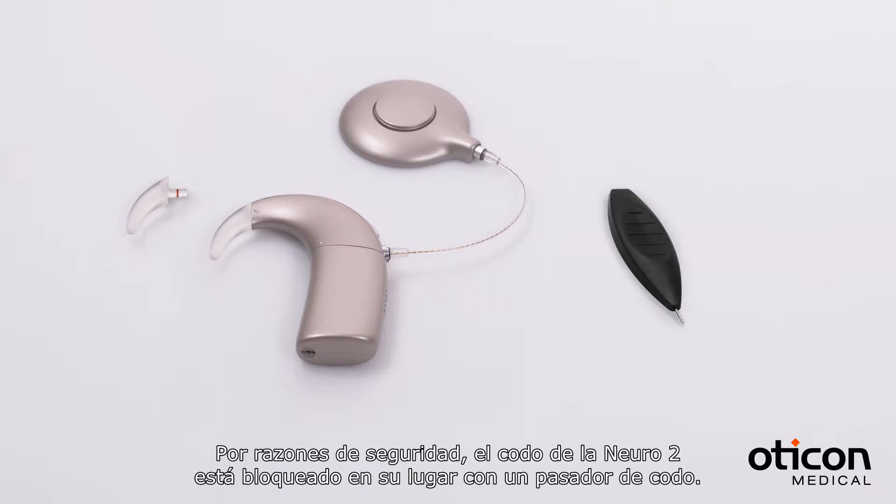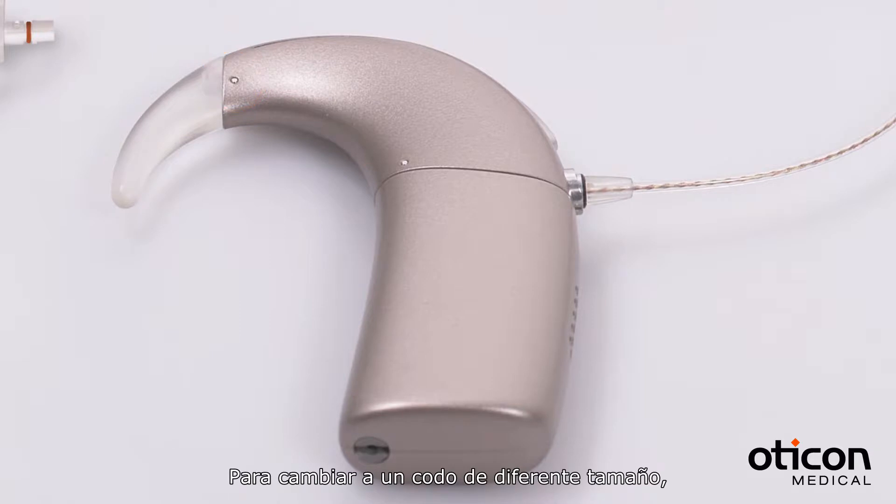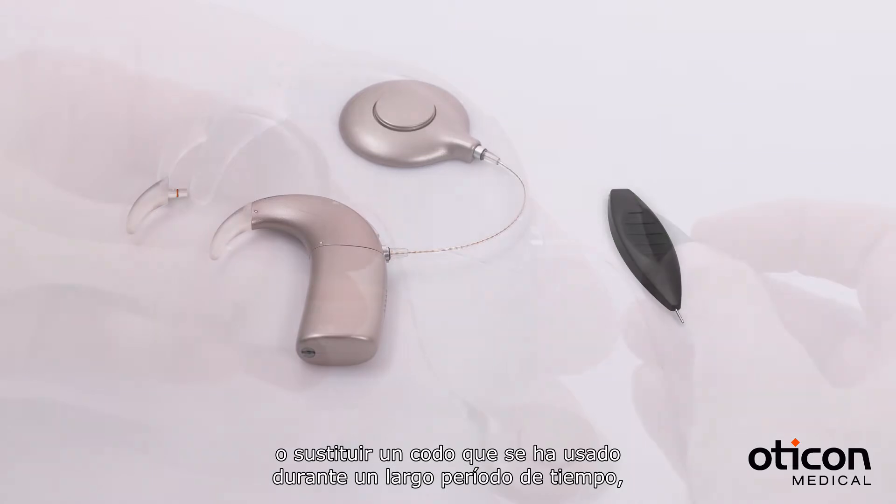For safety reasons, the hook of your Nero 2 is locked in place with a hook pin. To change a different hook size or replace a hook that has been worn for a long period of time, hold your Nero 2 with the hook facing left.